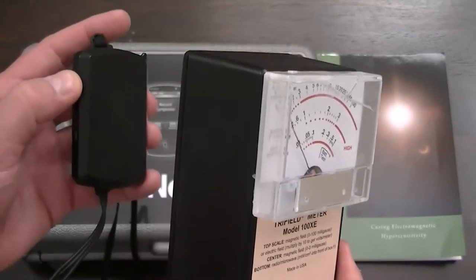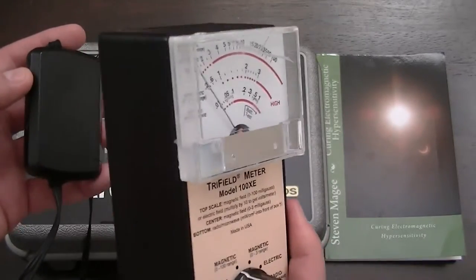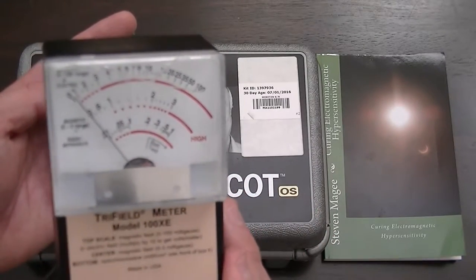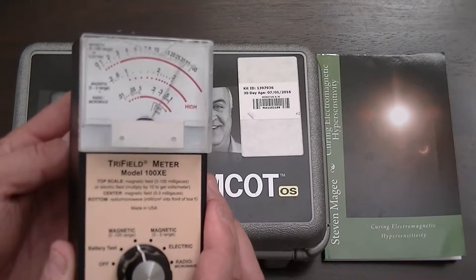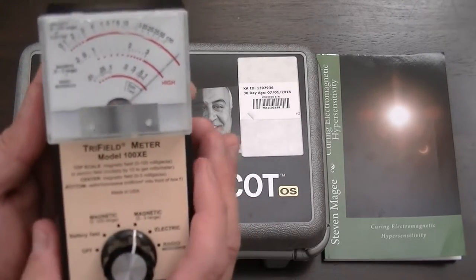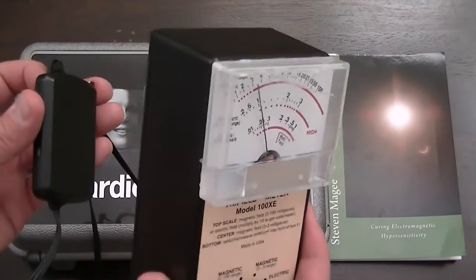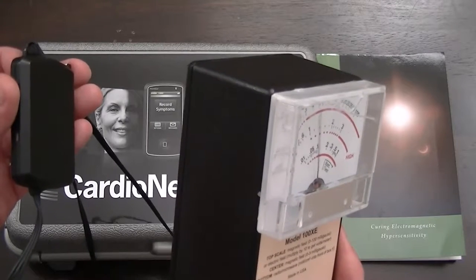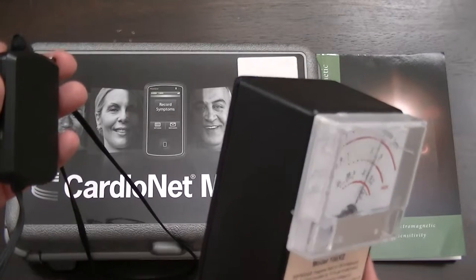Anyone who studies electromagnetic fields will realize that the orientation of the meter alters its sensitivity. This orientation seems to be the most sensitive. We definitely have field emissions coming out on the 0 to 100. Let's try the 0 to 3 range — you can see we're off the scale. With several inches of separation, you can clearly see that this is a field-producing device with an extensive field emission.